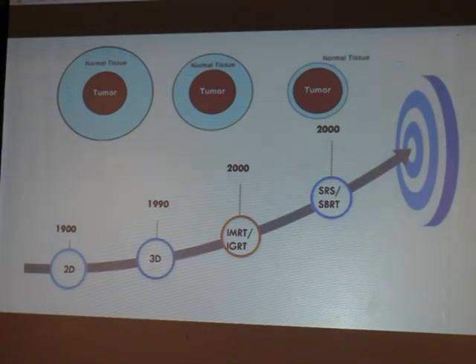Slowly, when the technology advanced, we moved on to 3D CRT, 20 to 30 years back. And as the technology advanced, there was an introduction of micro MLCs, with which we can draw the tumor and modulate the beam, so that we are able to give a certain dose to the tumor which is required to overcome the disease and cure the patient. But this itself is not sufficient.